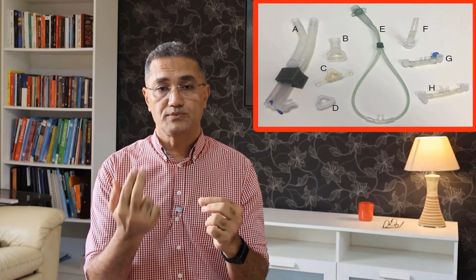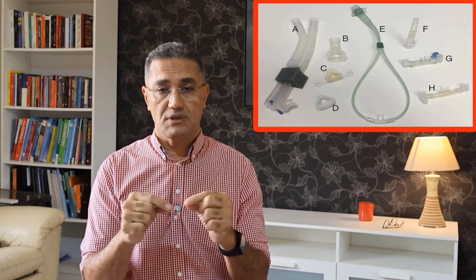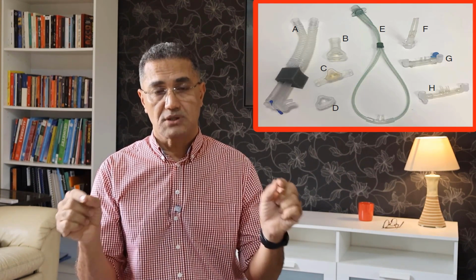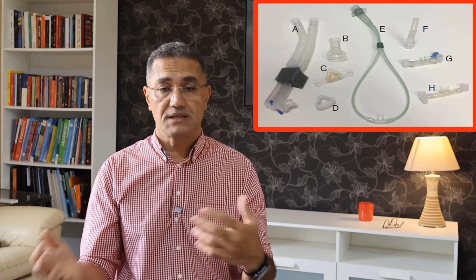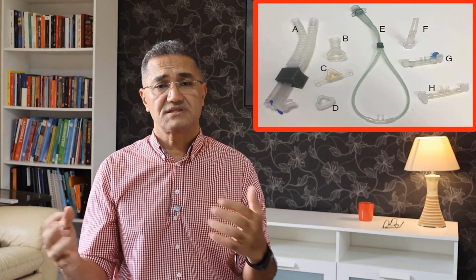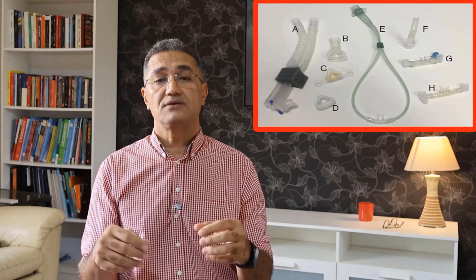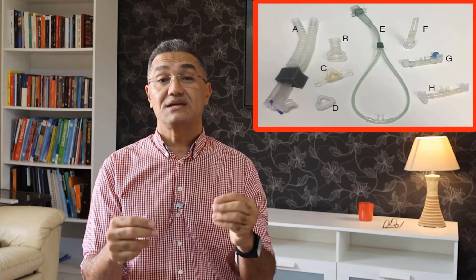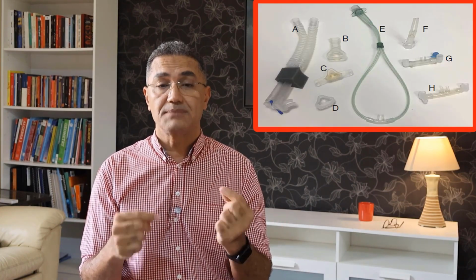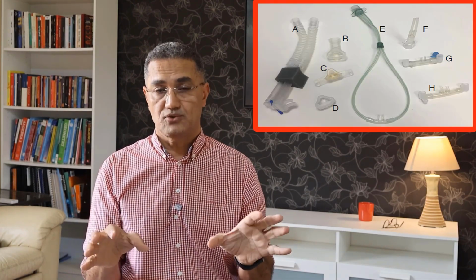This means that there is a small group who use the nasal prong, which goes a little bit inside. The prong itself tends to be a bit longer, mainly because it really depends on exactly what you're doing at the time. And sometimes there can be quite a lot of switching back and forth between the mask and the prong. But in the end, to sum everything up, the mask is generally better overall. That's it. But there's another important point about the prong. When the patient can't use the mask, you can use the prong instead.